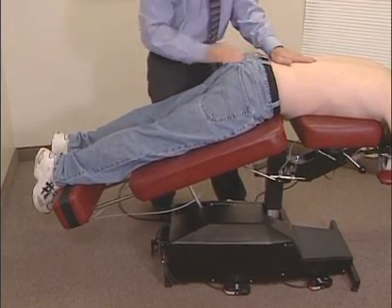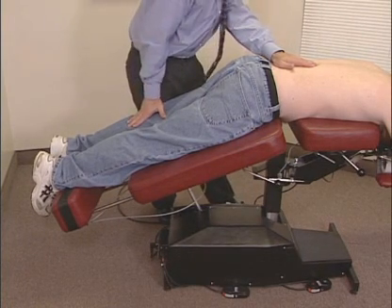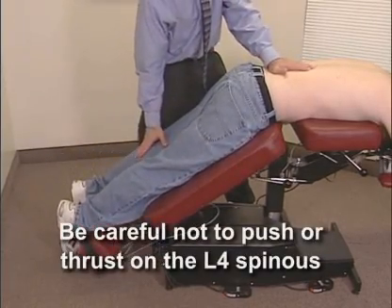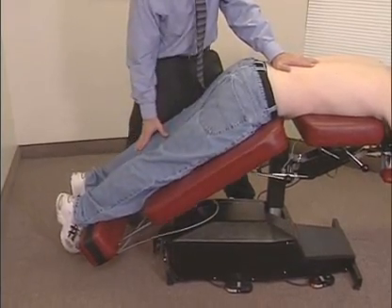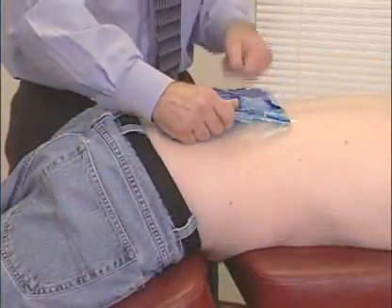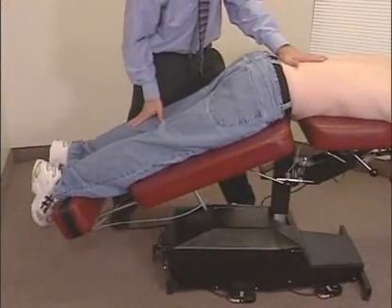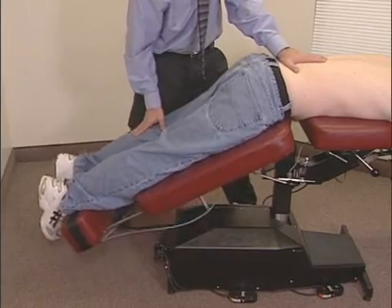Adjust the variable speed control to slow. Use a firm palm contact on the L4 spinous and hold. Turn on the table. As the table descends, be careful not to push or thrust on the L4 spinous. After the table has made 8 to 10 complete movements, stop the table and apply ice, appropriate therapeutic modalities, or light force adjusting techniques. This procedure decompresses the disc, decreases facet joint stress, and increases joint motion.